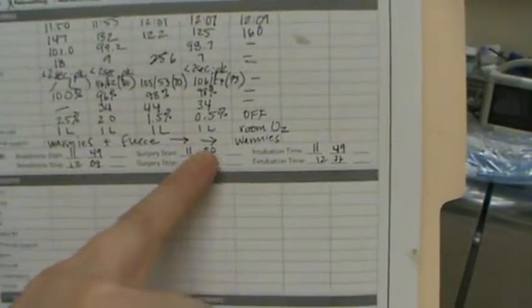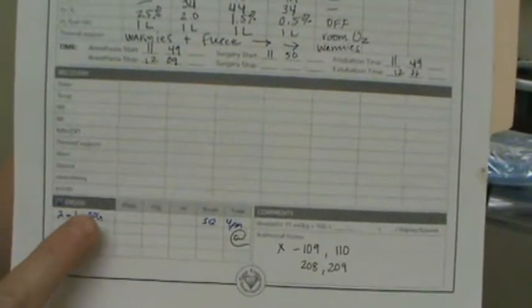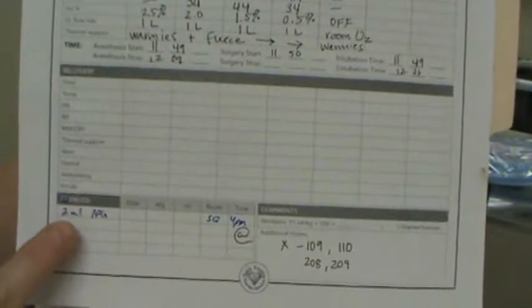One last bit here is our anesthetic start time and stop time. We have our surgery start time and stop time, and we have our intubation time and extubation time. Another little part down here: if we need to add any adjunct drugs or emergency drugs, we would write them down here. So we gave this patient a penicillin G injection, and that was 2 mLs. Any extra drugs that we administered during the procedure, and any notes that we'd like to put, go down here. In this case, it was that we did 4 dental extractions for this patient.